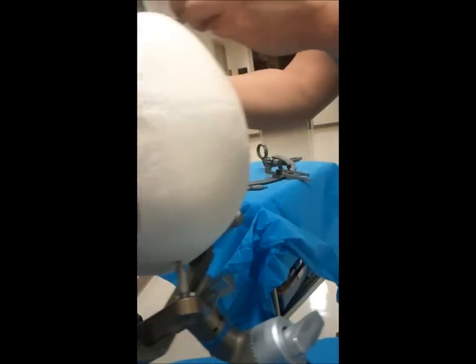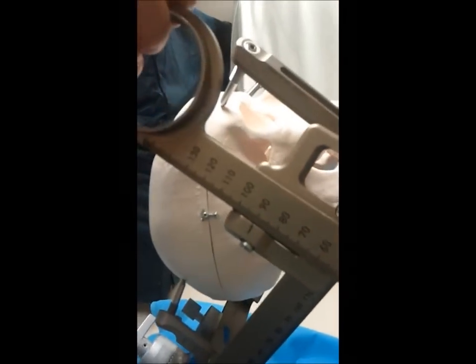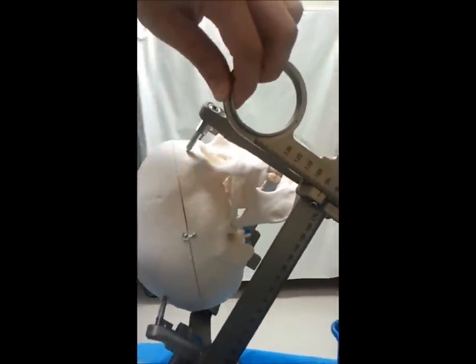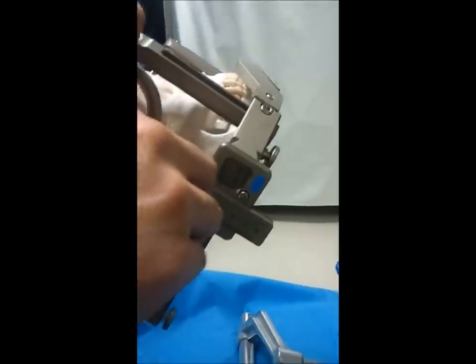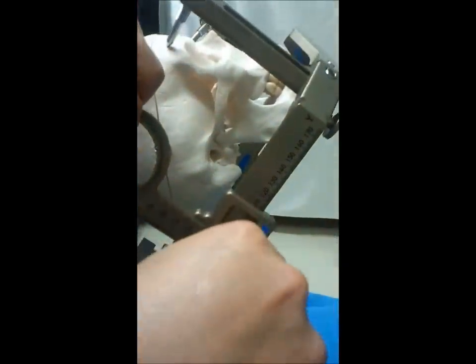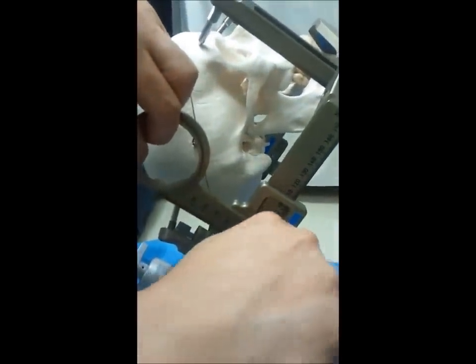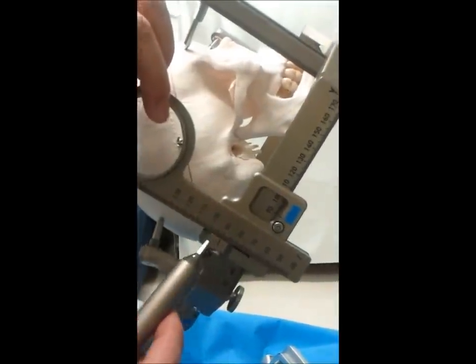On the patient's right side — as we swing over to the other side — it will look like the letter P in English when you're mounting on the patient's right side. Assuming I am sterile right now, I could have an assistant or do this myself — very carefully hold this portion of the ring and place it on there sterilely and slide it down. Sometimes if this is screwed on too tight you won't be able to slide it in, so you'll have to unscrew it carefully. We want to triple-check all our coordinates: the person screwing it in will confirm with another individual looking at the numbers, and have that individual swap places to confirm our AP — anterior-posterior — and verticals are all correct.